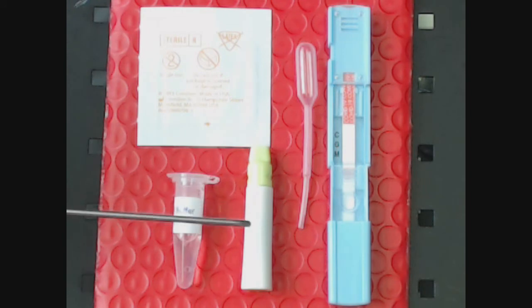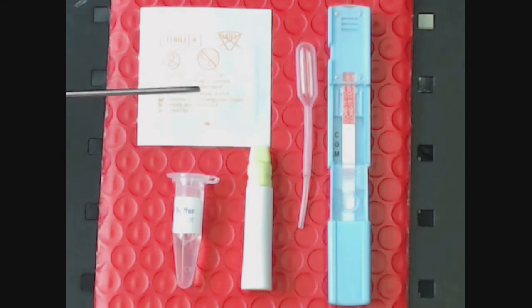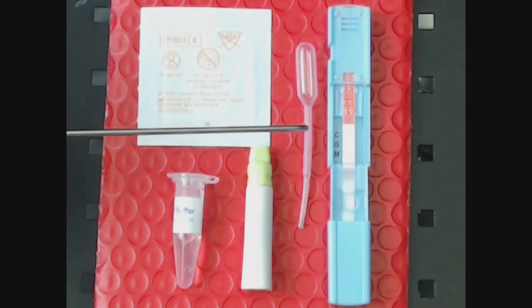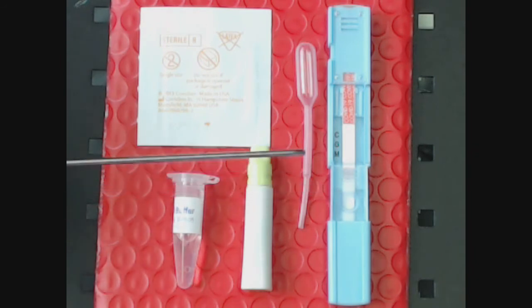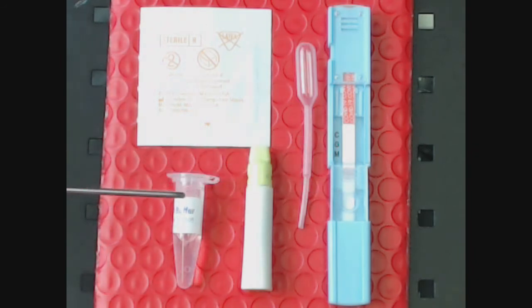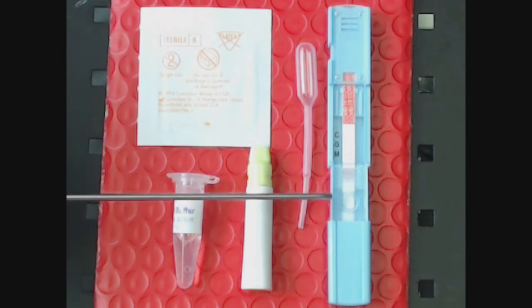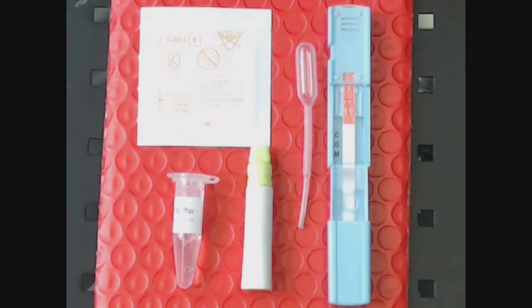Remember: alcohol swab, you swab the finger. You prick the finger, you draw up some blood. You swab again, and then once the blood expresses, you use a pipette, put the blood on the sample. Use the same pipette at that point to draw up some buffer—two drops into the sample well. Slide it forward and let the result be evident after the 10-minute run.